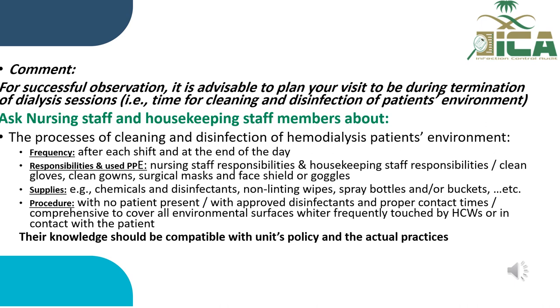Ask nursing staff and housekeeping staff members about the process of cleaning and disinfection of the hemodialysis patients' environment. Frequency: after each shift and at the end of the day. Responsibilities and use of PPE: nursing staff responsibilities and housekeeping staff responsibilities, clean gloves, clean gown, surgical mask, and face shield or goggles.